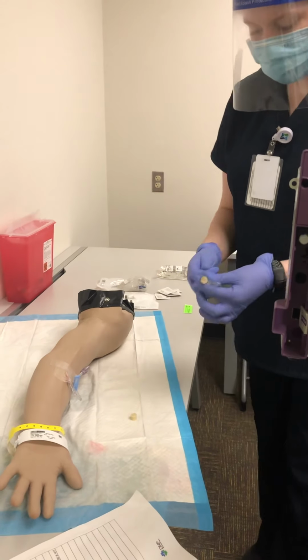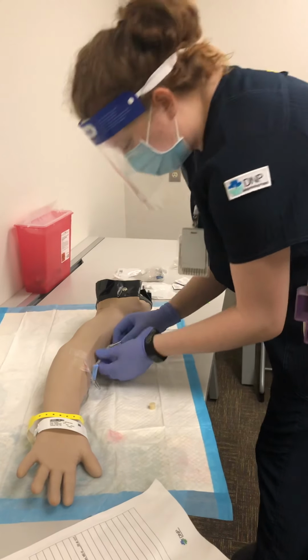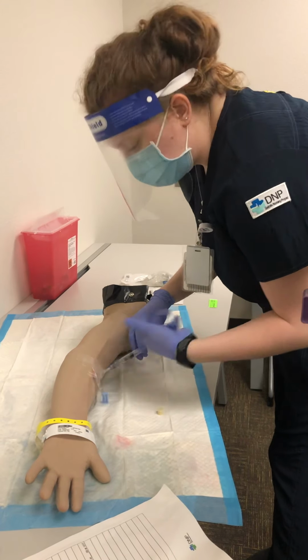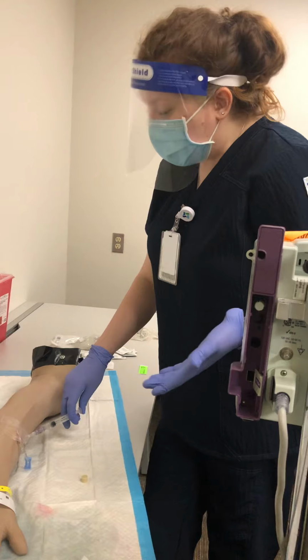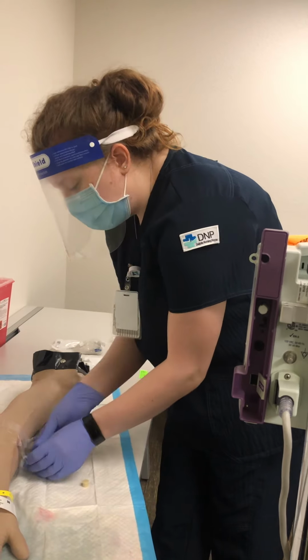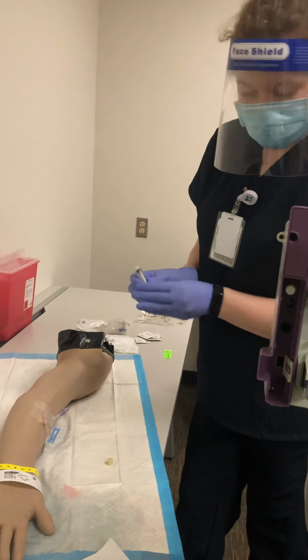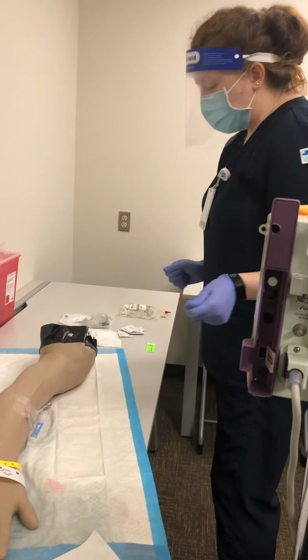Shirley, are you having any pain or discomfort from that specifically? No. Okay, and that should be helping your pain level pretty soon. So we are doing another flush. And this whole time I'm inspecting the IV site. While I prepare my next step of this skill, this gives me a chance to also monitor her respirations for any respiratory depression that would indicate that we need to reverse the effects of the opioid, and that would be administering naloxone. So I will be monitoring her respirations while we do this next part.